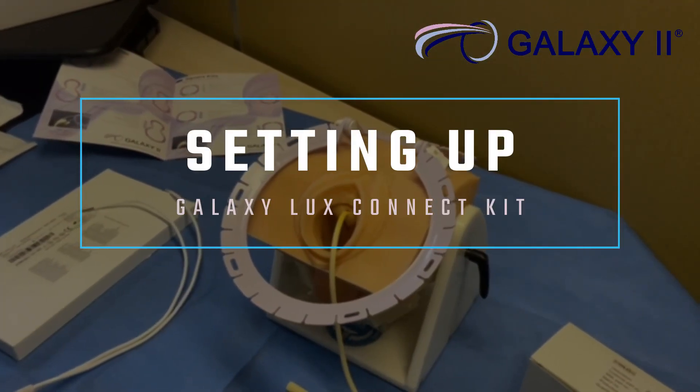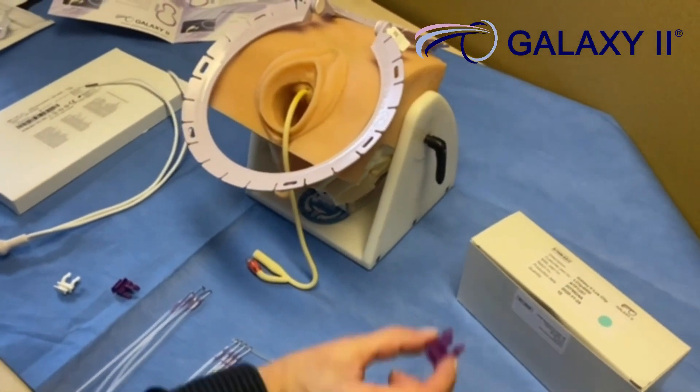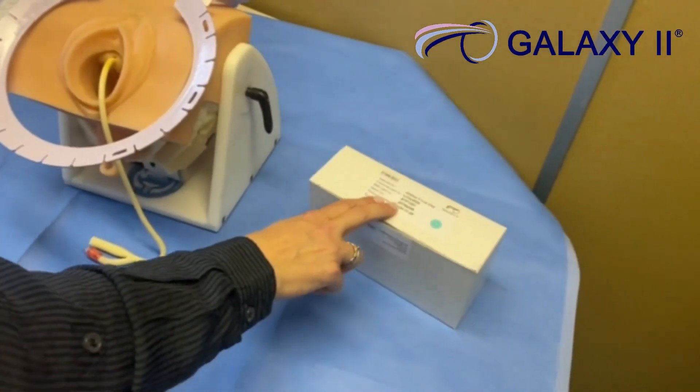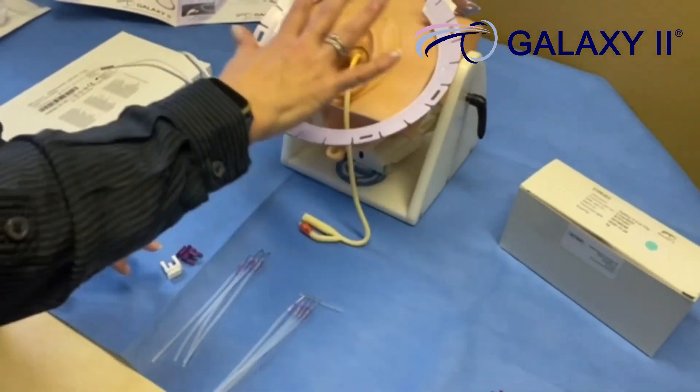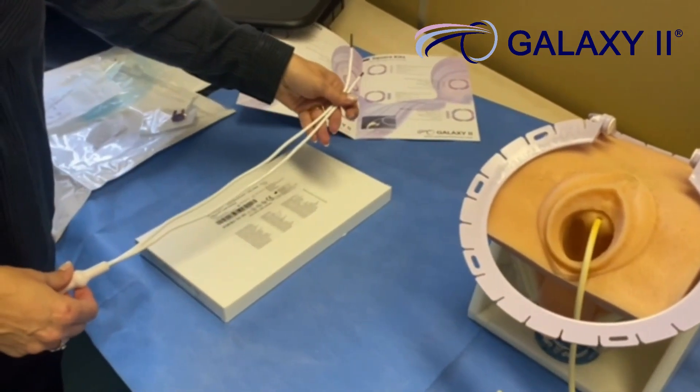You have now unpacked all the components for your Galaxy LUX kit. Your spare light clip is out of the box. The contents of the kit are also out of the box, and so is the Galaxy LUX bifurcated light.